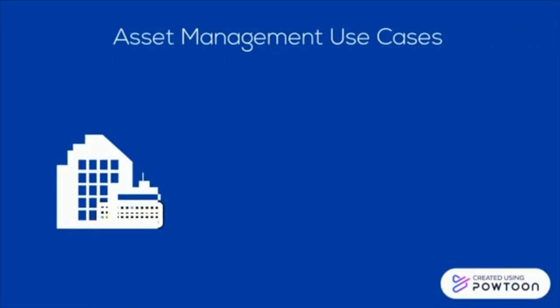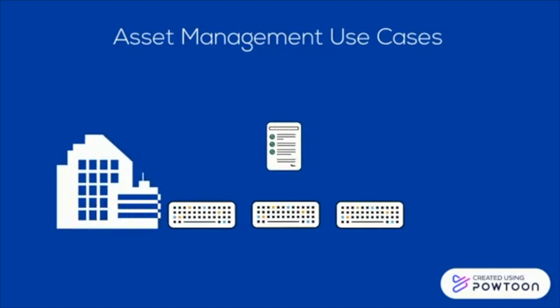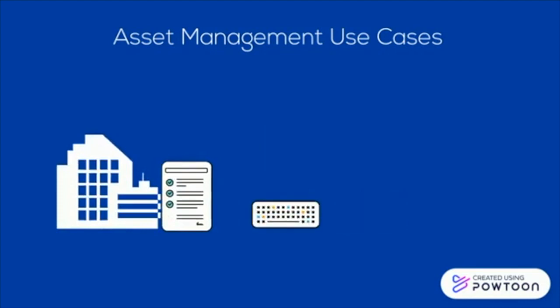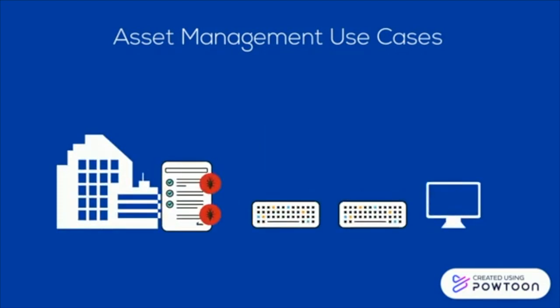Asset management use case guidance includes monitoring a hospital's medical device inventory against new vulnerabilities as they emerge. Updating software bill of materials data when a medical device's software is changed is important to keeping the device secure over its lifetime. An up-to-date software bill of materials listing allows a hospital to more quickly identify if the vulnerability is associated with any software components in its devices and know if those components are active on its systems. If one is found, the hospital can identify the level of risk and decide on appropriate actions.